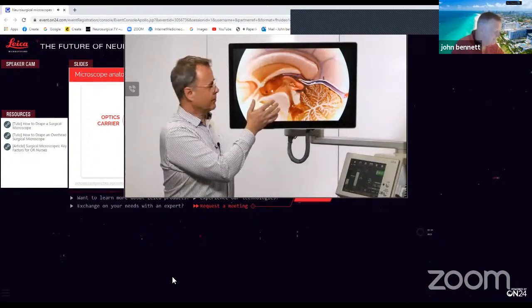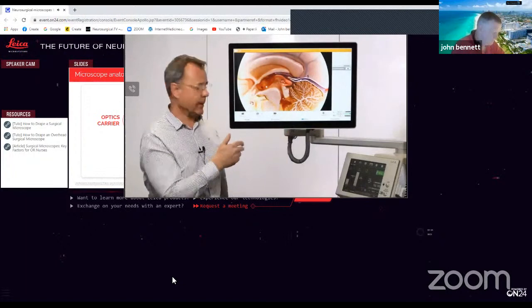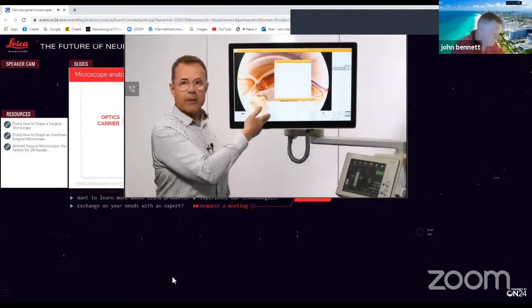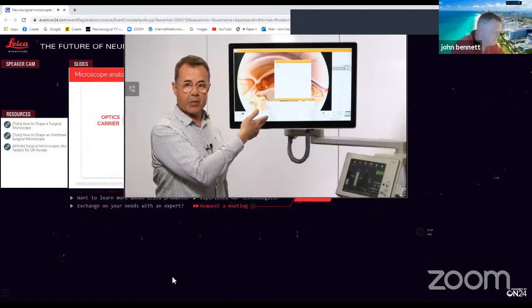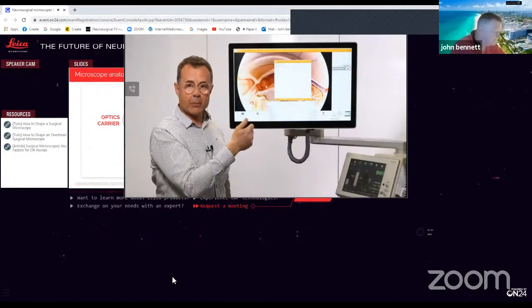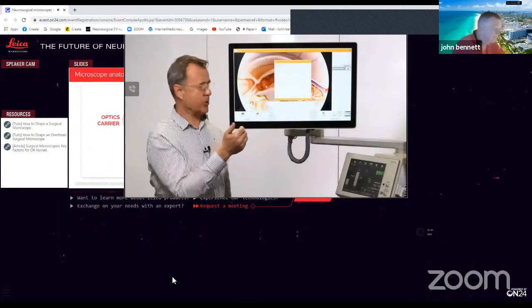When I touch the monitor, the parameters appear, so you can select a new case. Then it appears where you can enter the patient data, either here with a touch monitor keyboard, or you can import those data with DICOM. That's an option.